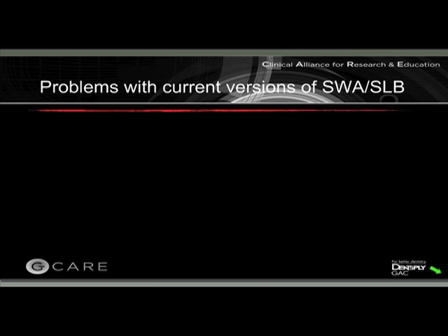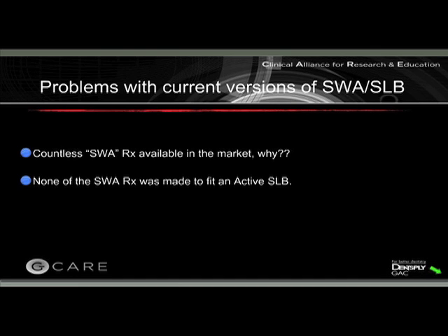So it's very interesting. And therefore, over the years, we realized that there were some problems with the current versions of the straight wire and self-ligating brackets available. Interesting is to see that there are countless straight wire prescriptions available in the market. The question is, why do we have so many different setups? Also interesting is to notice that none of the straight wire prescriptions was really made to fit an active self-ligation bracket. That's very important because I just mentioned that the way the arch wire interacts with the bracket is different. Since you have a clip, the whole story changes, and we need to understand how that clip interacts with the arch wires to design the proper mechanics and also the proper values of the bracket.